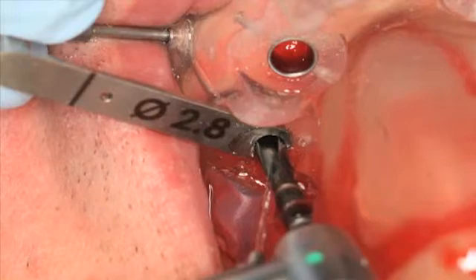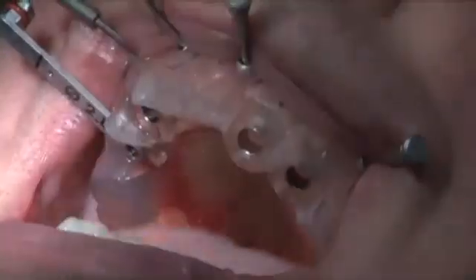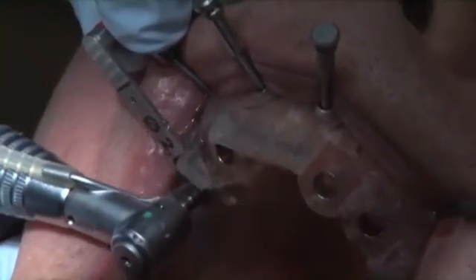Figure 12 and Video 3 show the next step drill — the osteotomy drill — which is a 2.8 diameter drill. We use a 2.8 diameter drill key, which will help guide this 2.8 millimeter diameter drill.